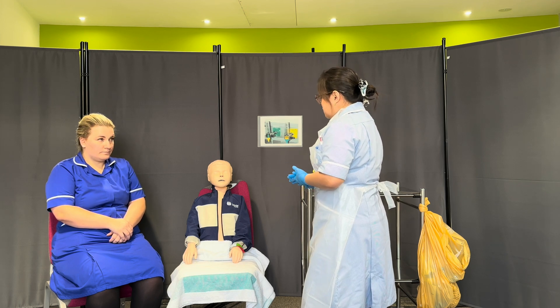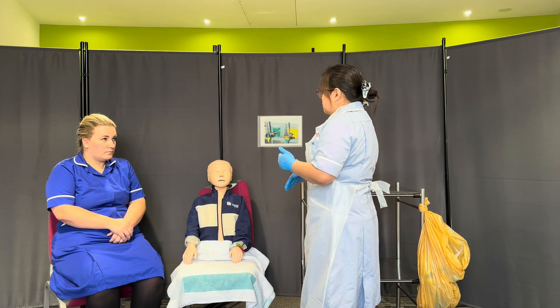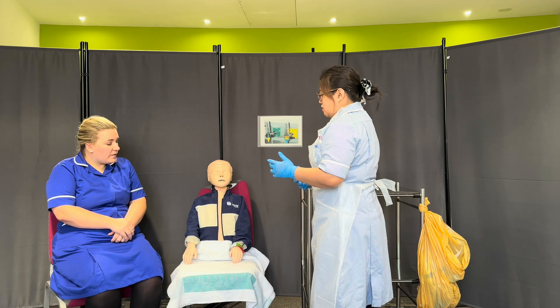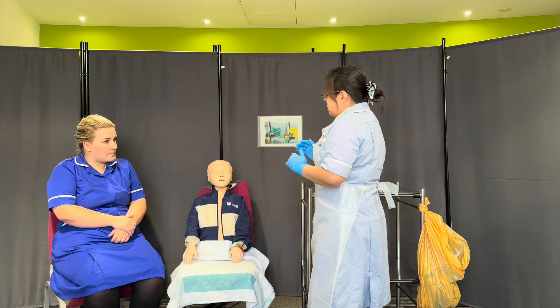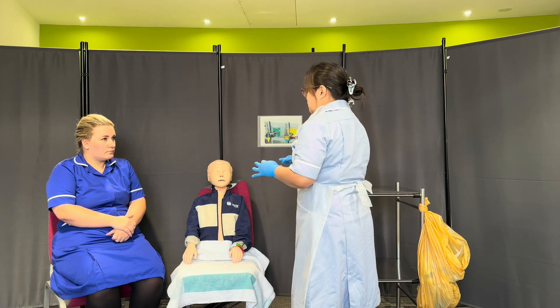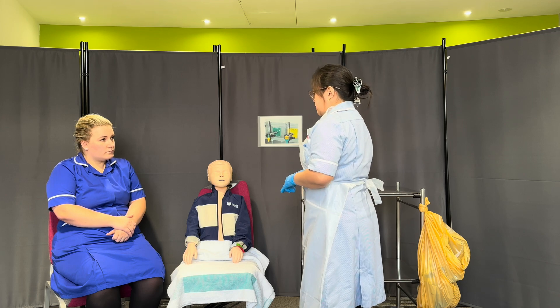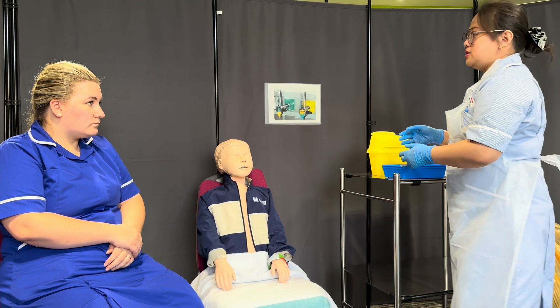Do you consent to this procedure before I proceed? Yes. Okay, that's good. I can see that my patient's hands are visibly clean. Do you remember which finger they pricked earlier? They did it on her middle finger on the right. That's good. So we need to rotate to a different site, avoiding the index finger and thumb. Is it alright if I do it on your left middle finger? Yes, that's fine. Okay, that's good to hear. I'll now proceed with the procedure.